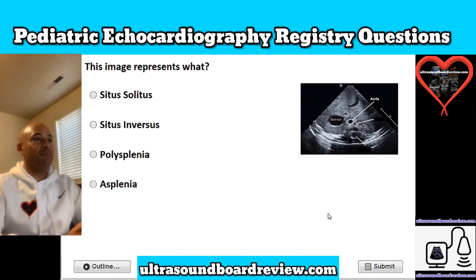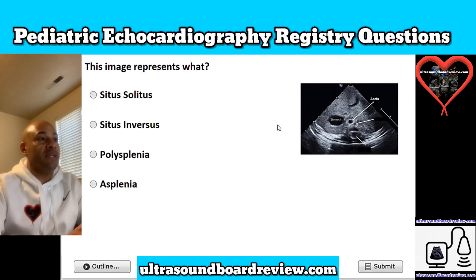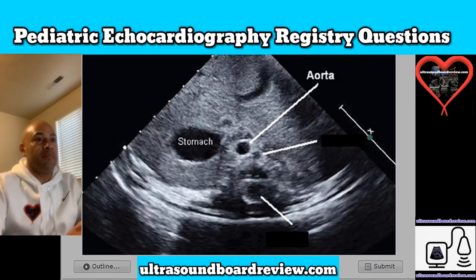Question 1. This image represents what? Is it A, situs solitus; B, situs inversus; C, polysplenia; or D, asplenia?